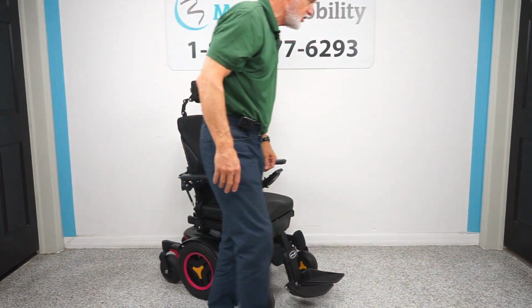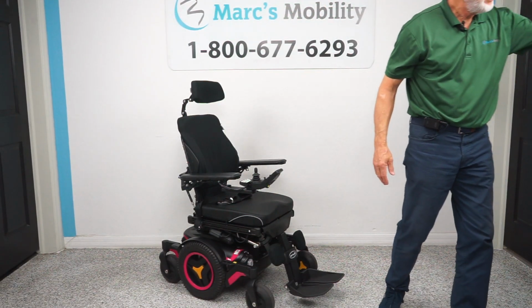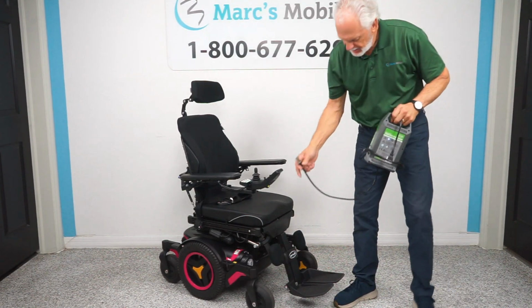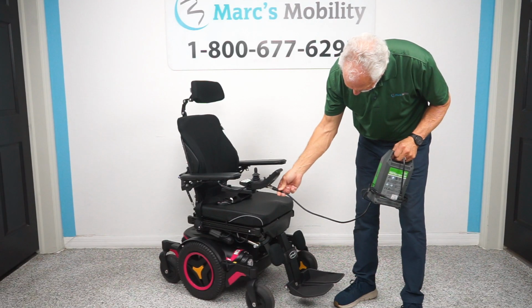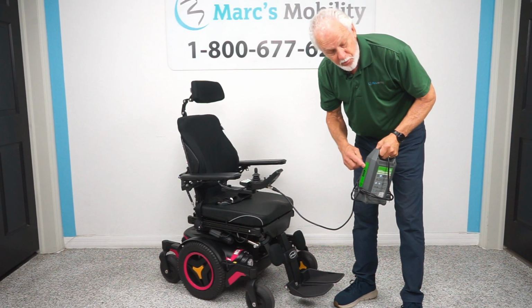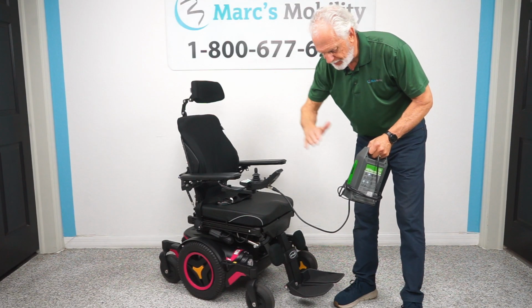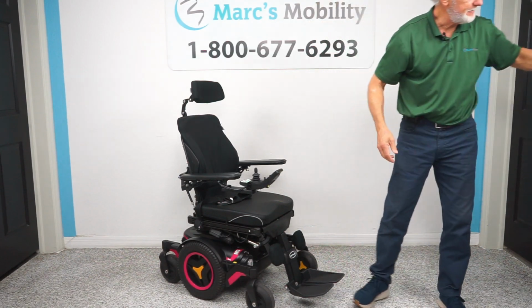And let's talk about the charger. When you go to charge this chair, you will use your charger right here and you'll plug it right there. And as soon as the light goes to full or 100% or green, the charger knows when the batteries are full, it'll cut off when the batteries are full, okay?